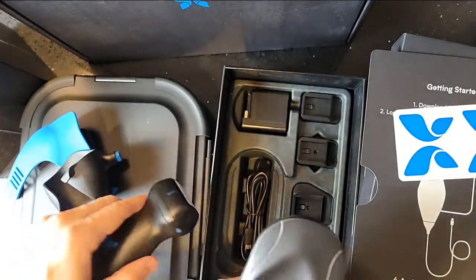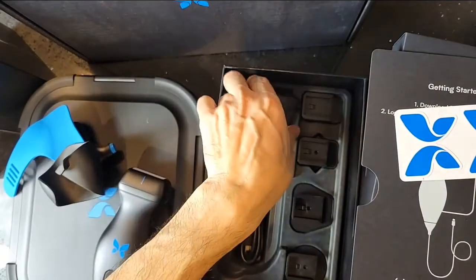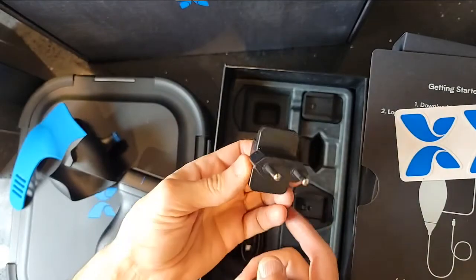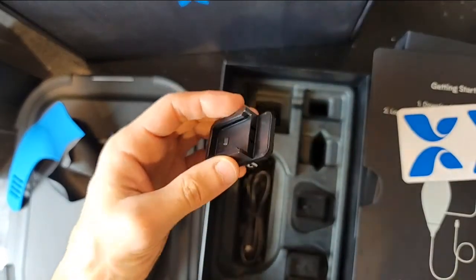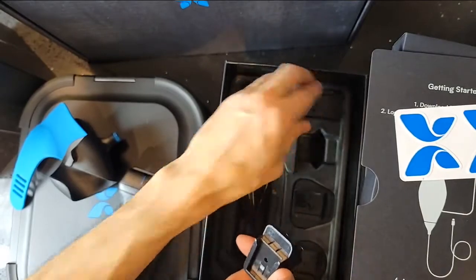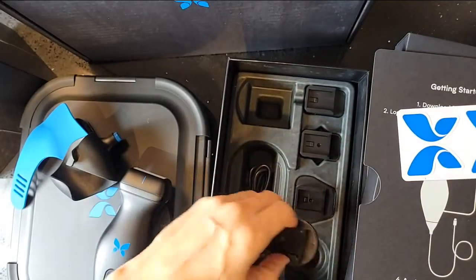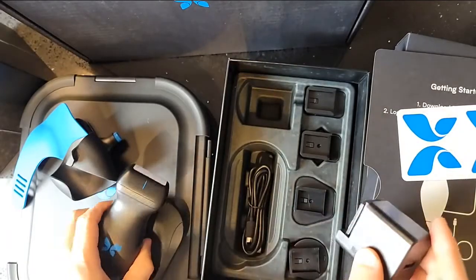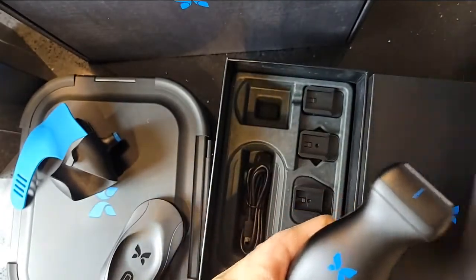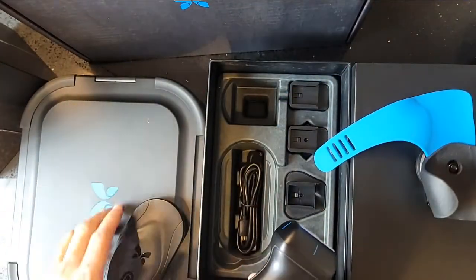Also in the box there's generic instructions on downloading the app, some Butterfly stickers if you're a fan, what appears to be a docking or holding station, a charger, and international adapter plugs for different countries — so if you're traveling and need a different charger, they have you covered. I'd still check voltages before plugging in. The Butterfly IQ Plus is currently retailing for $1,999, the holster for about $49.99, and the carrying case for around $199.